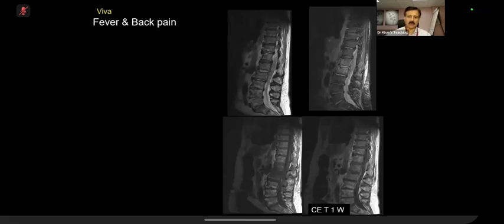And if it is a phlegmon, you just tell them that there is nothing drainable. So the basic concept, just remember it like this: phlegmon is inflammatory tissue, which enhances. And then when there is pus formation, that is an abscess. And by definition, pus will be liquefied. There will be surrounding enhancement, but the pus will not enhance.